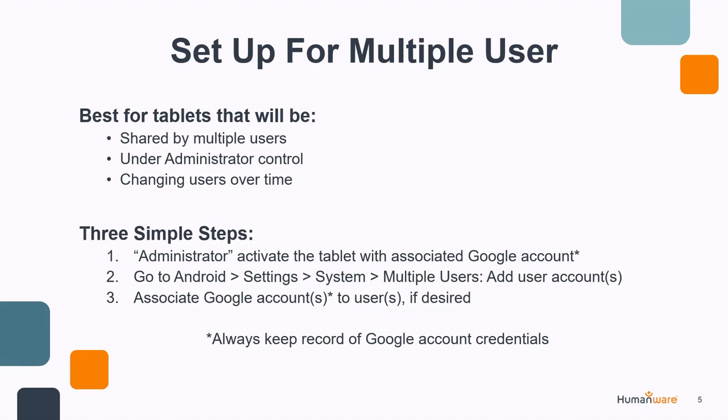Again, note that asterisk there. Always keep record of the Google account credentials, especially at this administrator level, just like you would with an individual account setup. It's not so important with the sub-users or the multiple users that will be created, but it's absolutely imperative to have them for the administrator that activates this tablet. Again, if they are forgotten, it will require shipment back to HumanWare for us to perform the reset of the tablet.